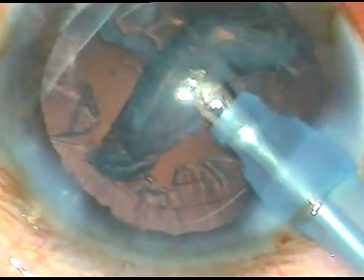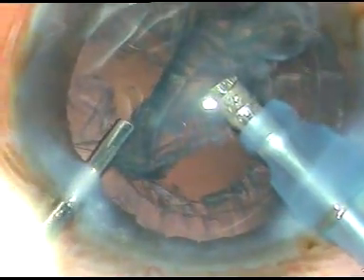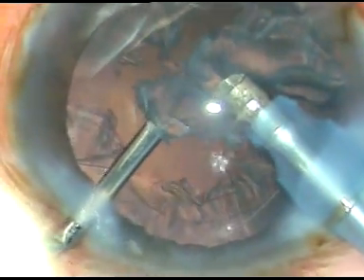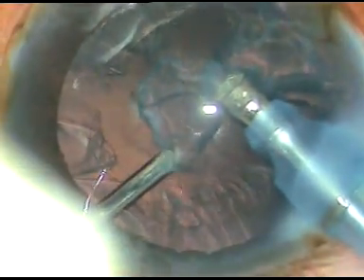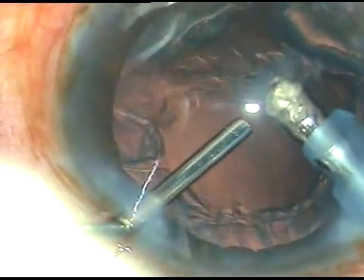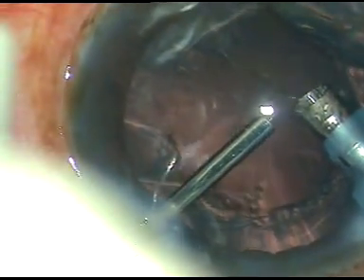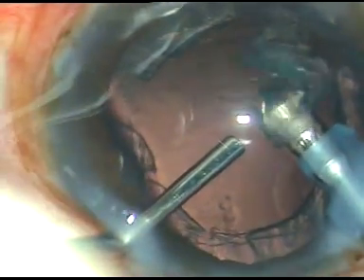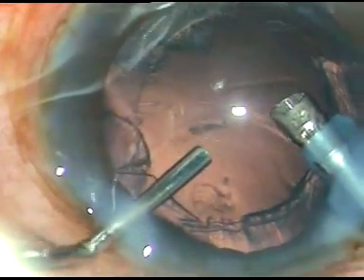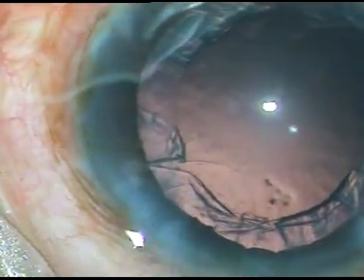And now when I am at the last portion of the epinucleus, I inject the 23 gauge cannula with viscoelastic substance. I hold the needle cannula and I ask my assistant to inject visco behind this last fragment. And now I emulsify this fragment. And when it is shallow again, I inject some more visco. Means my assistant injects visco, I hold the needle cannula, and thus I remove the epinucleus. And as I come out, I ask my assistant to inject visco again.